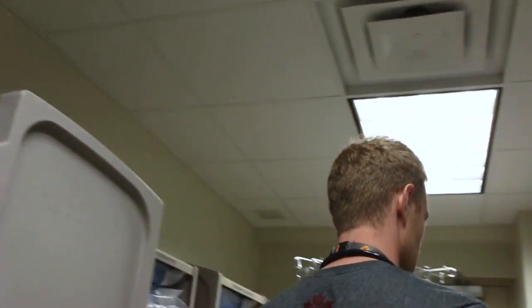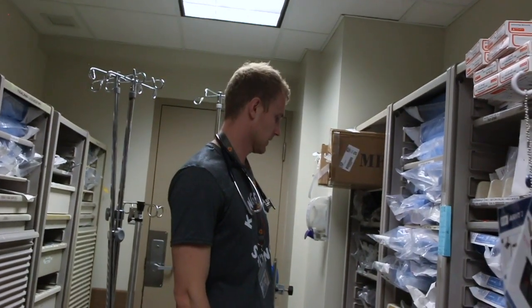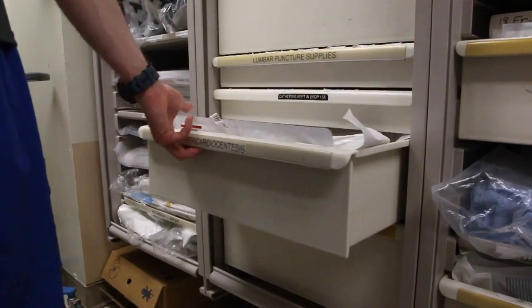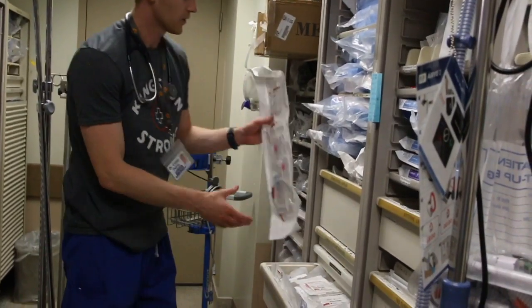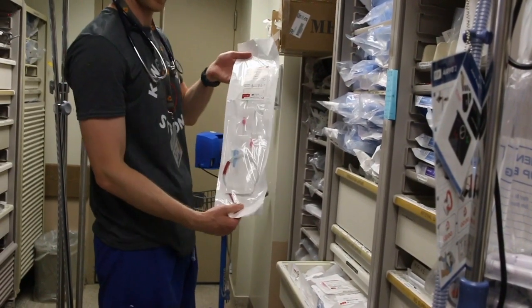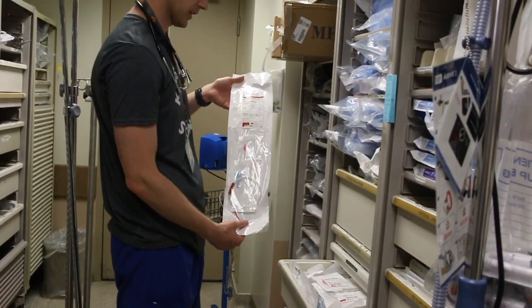The equipment you're going to need to do a pericardiocentesis in our emergency department is located in the hallway behind A6. We have a pericardiocentesis drawer which features a commercial pericardiocentesis kit. We'll lay it out for you a little bit later.